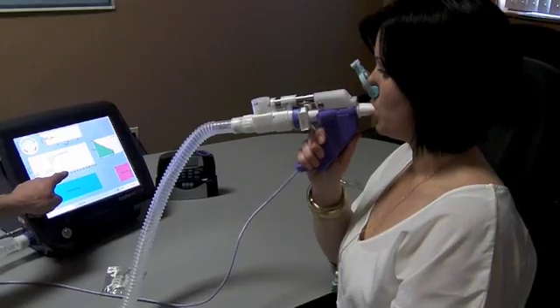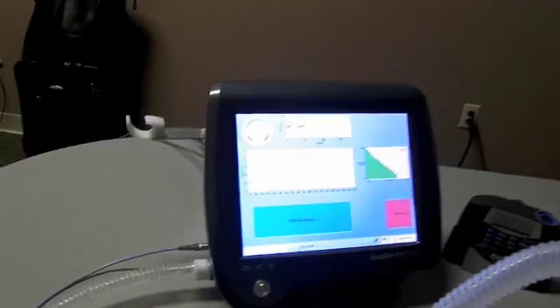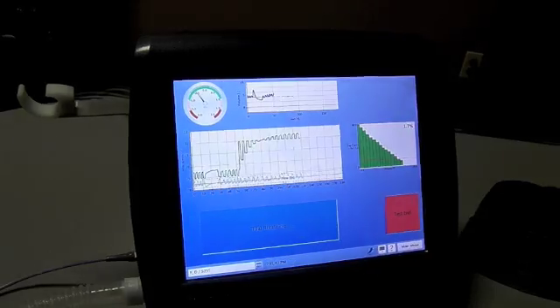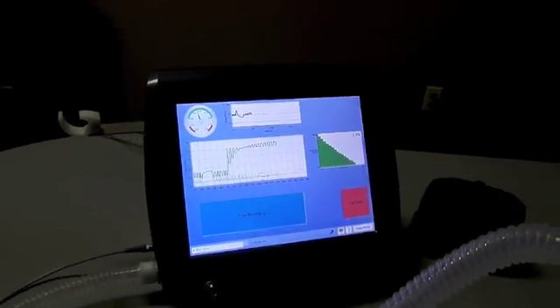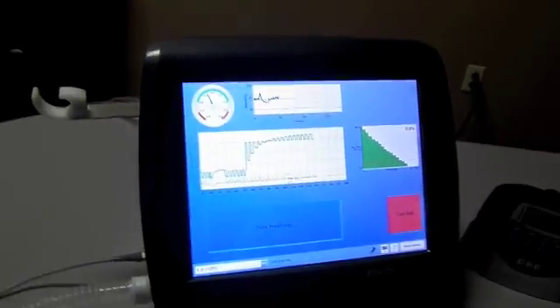As you can see here, she's still within her range of the 1.5 plus or minus liter per second. Now she's below the 2%, now she has to achieve so many, and the machine will automatically stop.